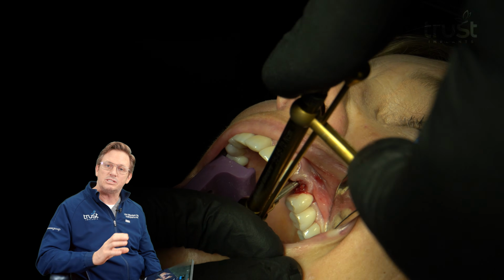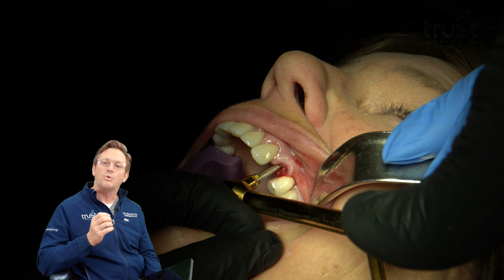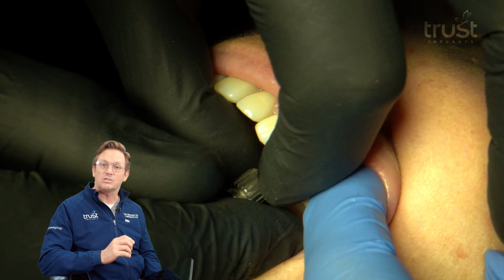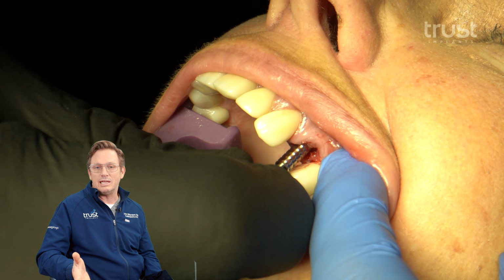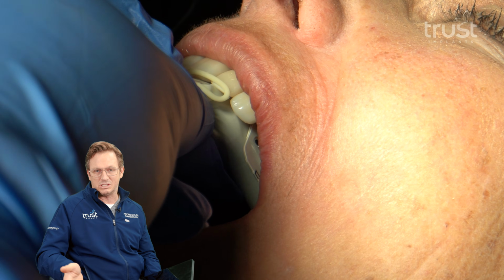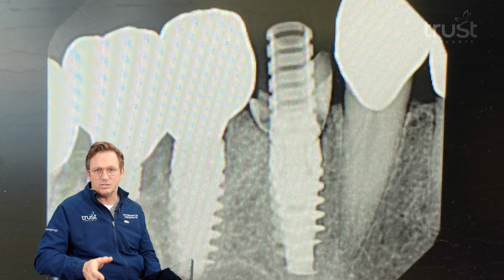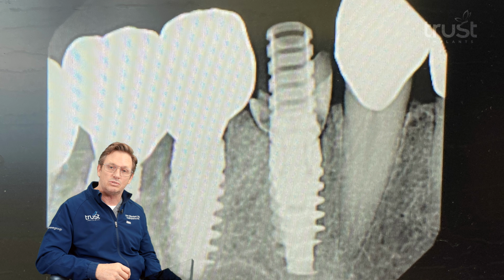What that does is it helps to create the architecture of the soft tissue. When I make the provisional, I'm already starting to create the architecture of the soft tissue, so that when I do the final crown, a layperson or even some dentists would not be able to tell that this was an implant, because we've preserved as much of the architecture of the soft tissue and bone as we possibly could in order to get the most ideal aesthetic and functional result.